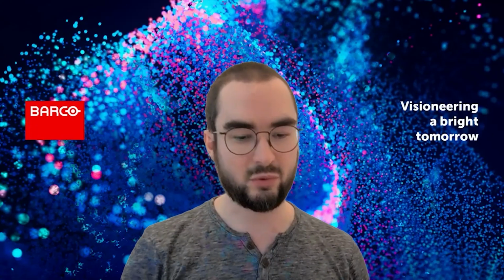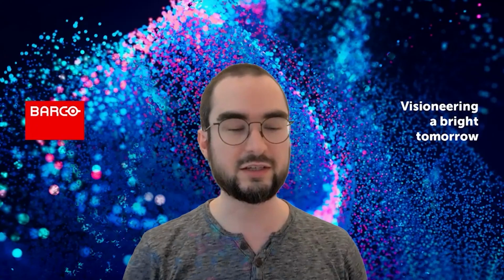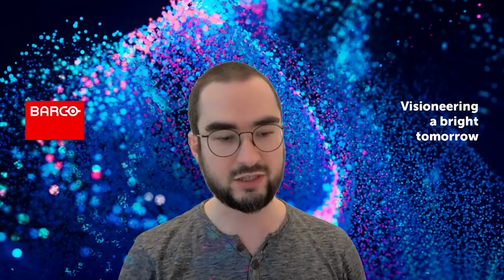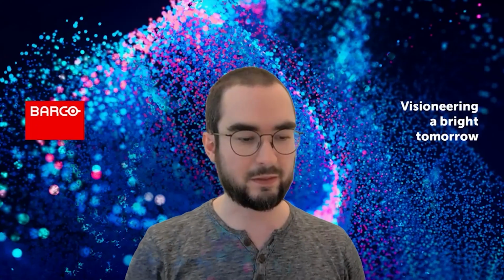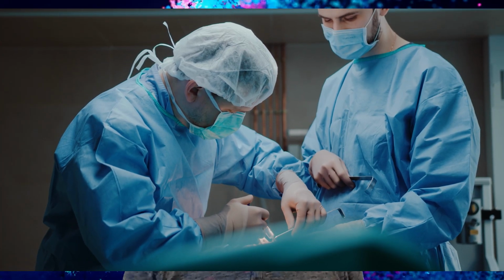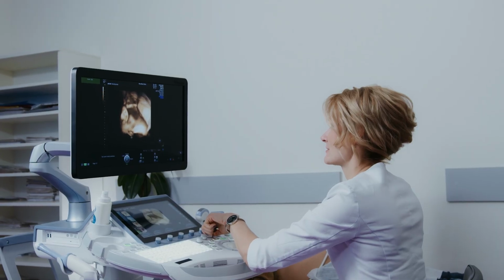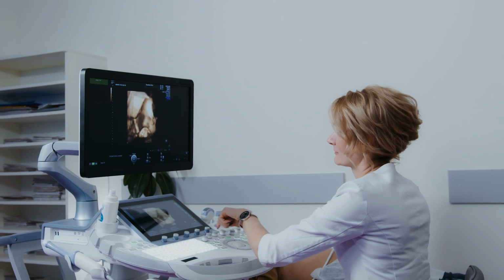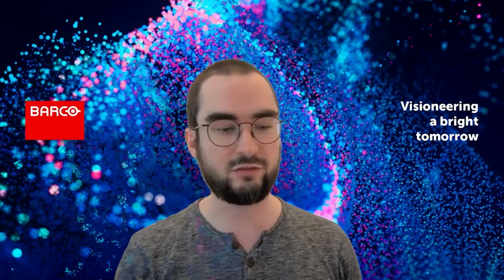The one thing that's important in the future is that these visualizations, to be successful in clinical and healthcare environments, need to be integrated in existing workflows. That means that a clinician, be it a surgeon, for example, has very little time and is always doing something. You don't want to interrupt this. So the device that you use to bring these experiences to clinicians has to be capable of doing both of these things. And that's where 2D and 3D switching is very important.